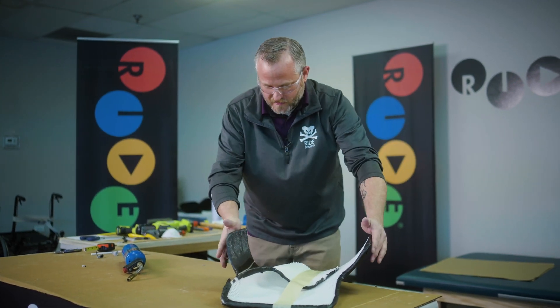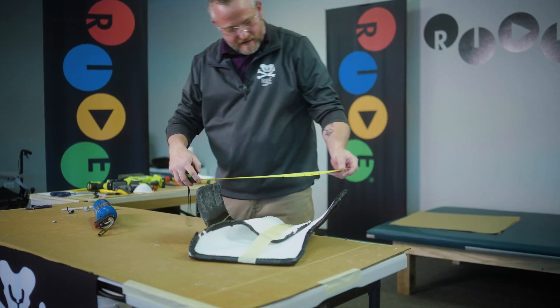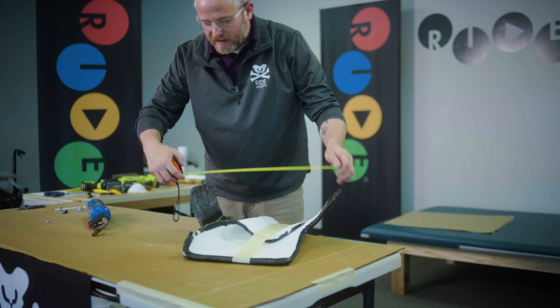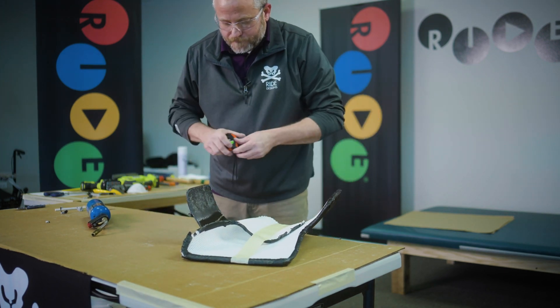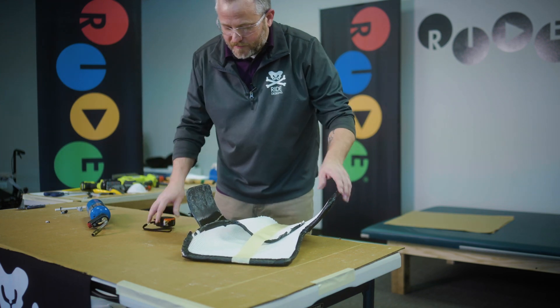I'm going to try to bring this in about an inch to where it was — it was 19 and a half before. I went to 18, so a little bit too far. 18 and a half — pretty good.